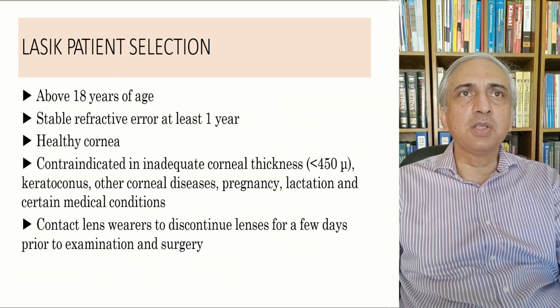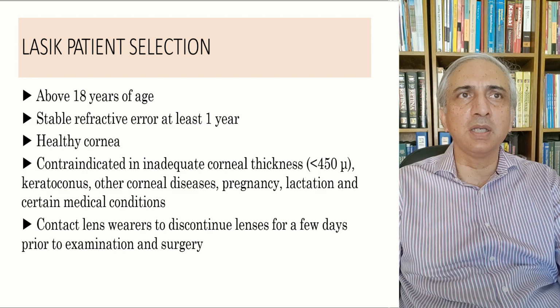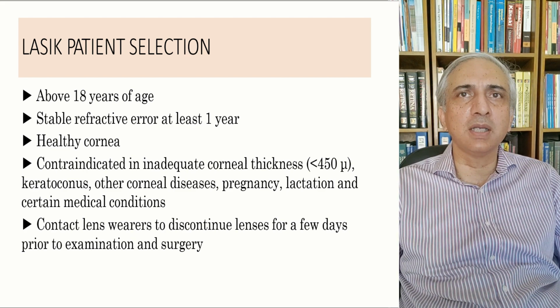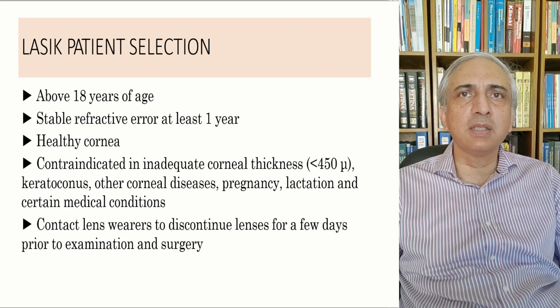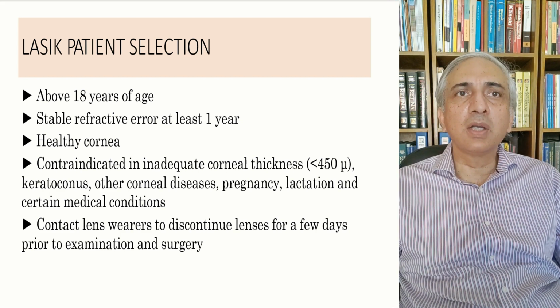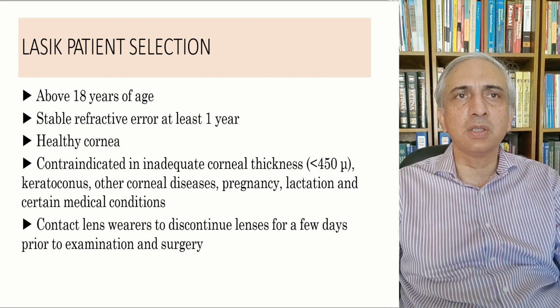So LASIK patient selection: above 18 years of age, stable refraction for at least 1 year, healthy cornea. It is contraindicated in inadequate corneal thickness, less than 450 microns, you will not do it. Keratoconus, other corneal diseases, pregnancy, lactation, and medical conditions which we discussed before. Contact lens wearers should discontinue lenses for a few days prior to examination and surgery.